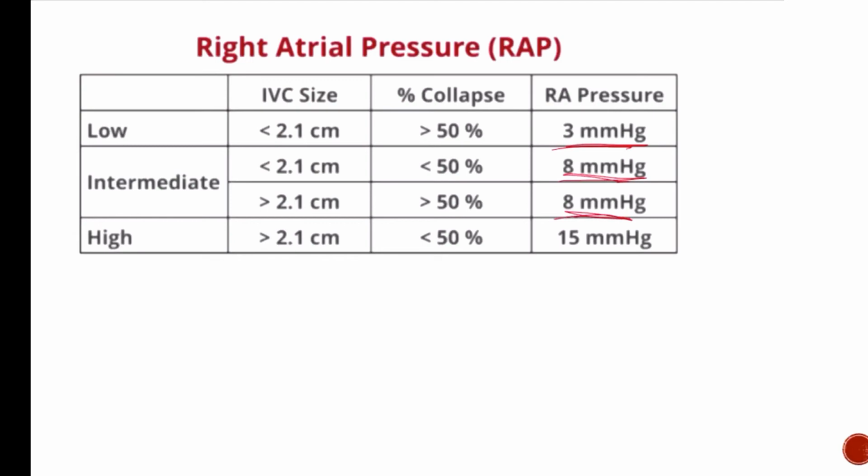In clinical practice, when you truly are trying to measure your right atrial pressure and compare it to IVC assessment, there's a lot more variability. It's a lot less reliable as a true calculation of right atrial pressure. In fact, some more recent literature tells us that SVC variation and SVC changes are more consistent with right atrial pressure because you're less prone to intra-abdominal fluctuations in pressure. So someone who's had a recent surgery, has intra-abdominal hypertension, is coughing a whole bunch, right? Those patients are going to have a less reliable right atrial pressure assessment. But this is what's tested, and this is what's used in classic echo for right atrial pressure estimation.